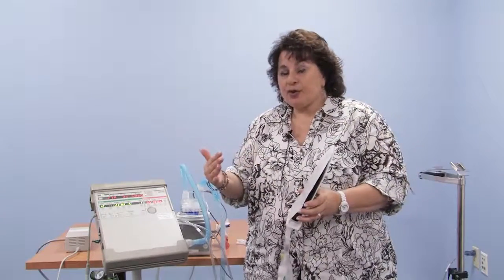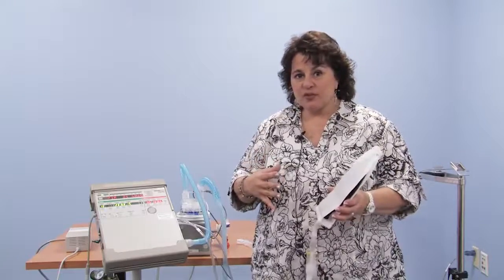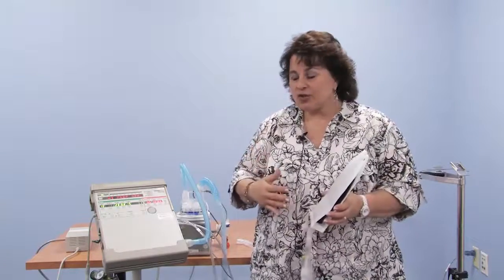And then you and your therapist will talk about what is safe in your home versus what is your child's normal numbers. So if your child normally has pressures in the higher 20s, you may have to turn the alarm up to the higher 30s. It really depends. If their pressure is very low, you might set the high pressure low. So within a range, our standard practice here at Boston Children's Hospital is to set the pressure 5 to 10 above and below what the patient's pressure is within that range.